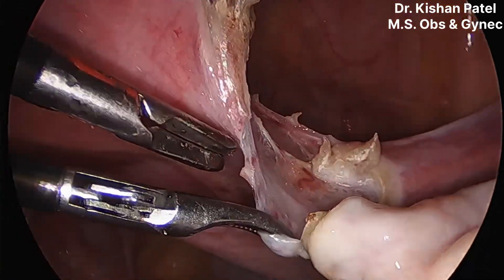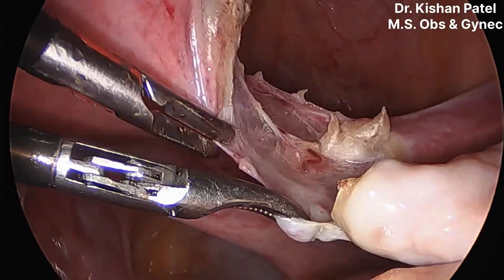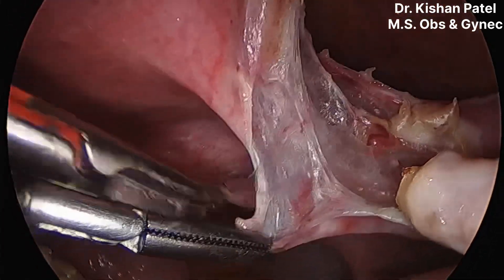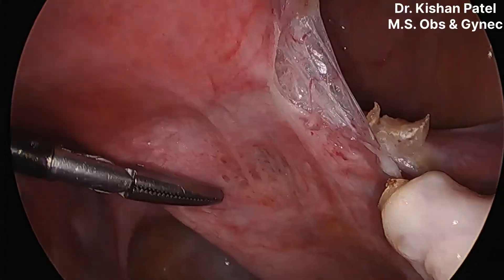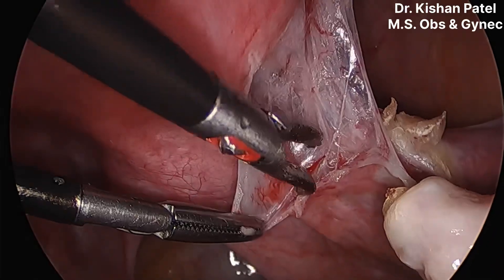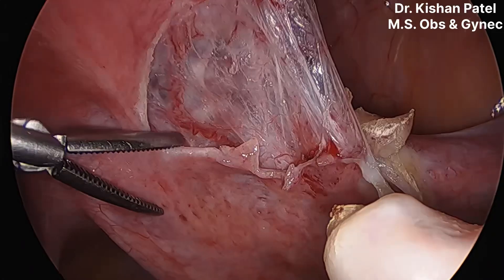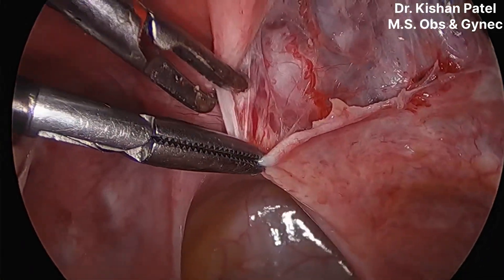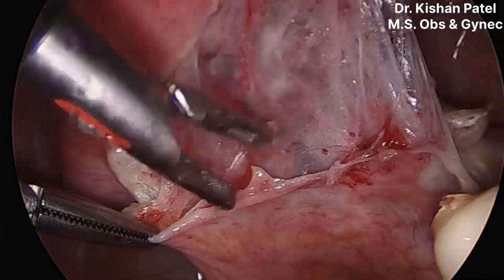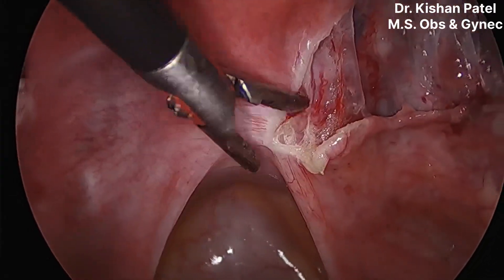Now we are separating the posterior fold so we can skeletonize the uterine artery very beautifully. You can see I am holding the peritoneum with a Maryland forcep and cutting with the shearer. I am using a bipolar cutter shearer - Indian made shearer - as an energy source. You can see the uterine artery very beautifully beneath the peritoneum. It is very tortuous in this case, so we will now cut the right uterosacral ligament.